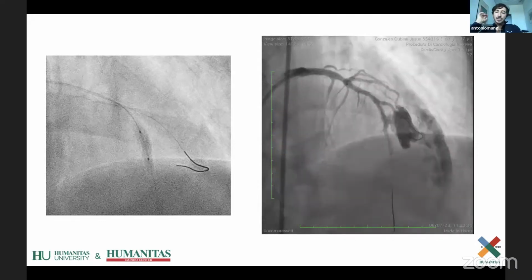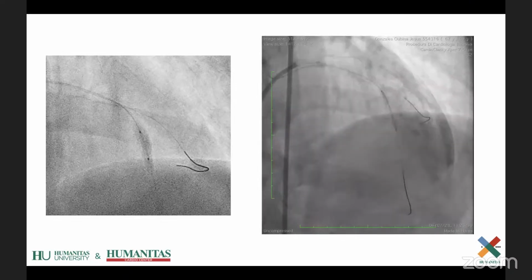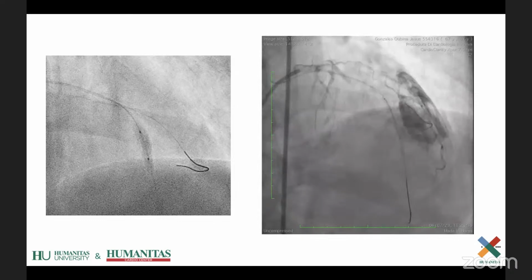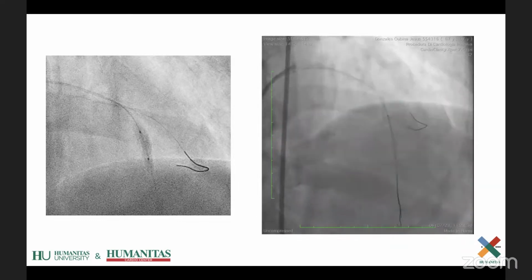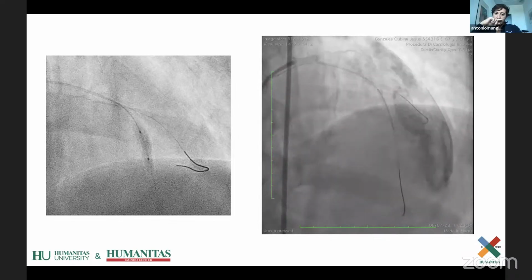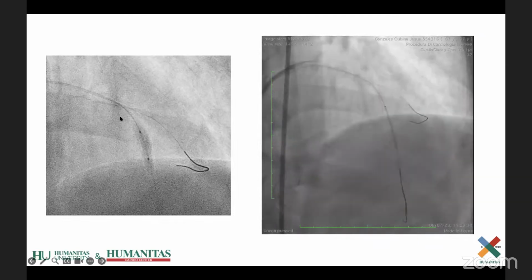Yeah, but I tell you what this is just for... No, I understand, but I'm just telling you about the balloon. Look at the balloon. The moment you see the balloon inflated in this way, I tell you this is a sign of rupture there. So just get it in the room before you deflate, and then you could do whatever you want, just to be on the safe side.